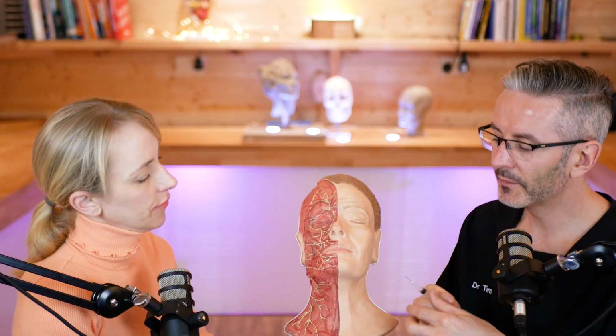Probably the majority of people are now. There's still a bit of debate, but I think it's a bit old hat to say there's no evidence when we've all seen the positive aspirations. You do hear that. So the question is, how do you do it effectively and sensitively without causing unnecessary trauma? So let's think about all the different ways you could aspirate and either cause trauma or have a meaningless aspirate.